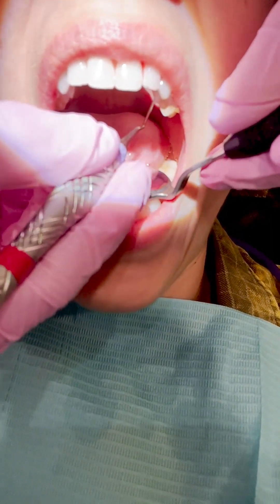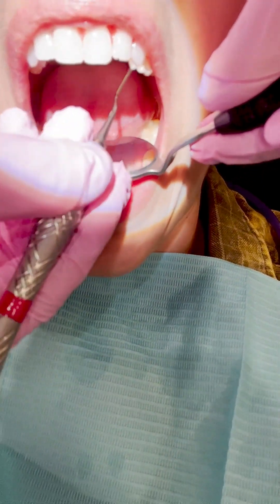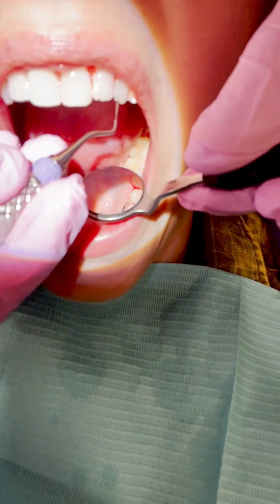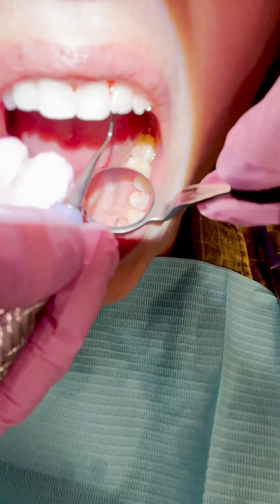I overstroke all my strokes, triple checking, blowing air. Honestly, the only way you should be doing dentistry as a clinician is if you are using multiple methods of checking yourself — cavitroning, scaling, blowing air, exploratory strokes. Flossing at the end is another way to check the contacts and make sure you got everything out.